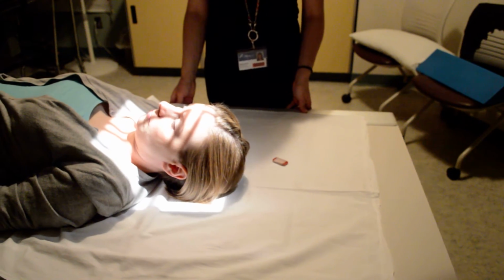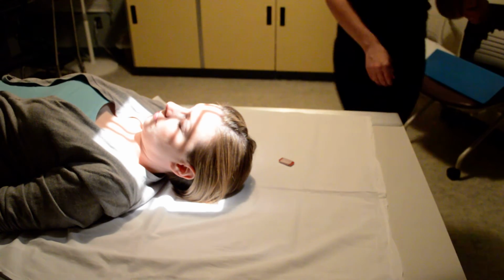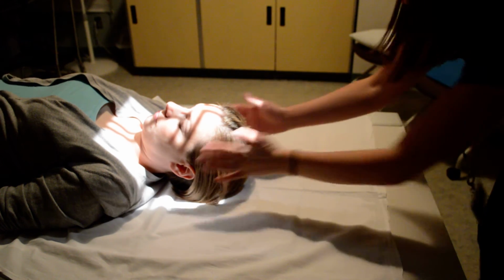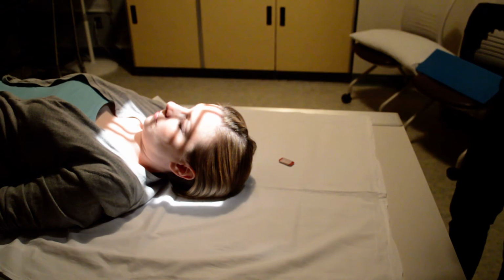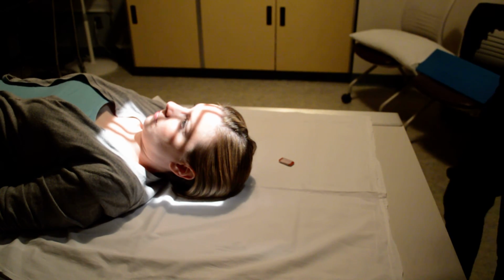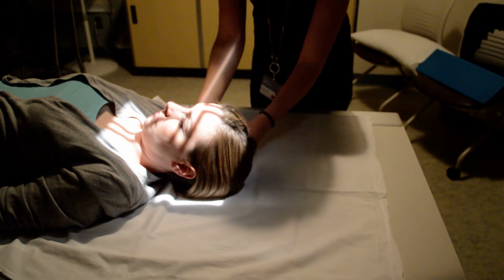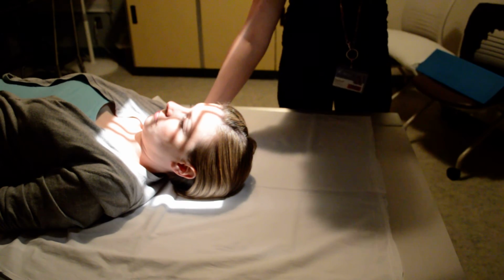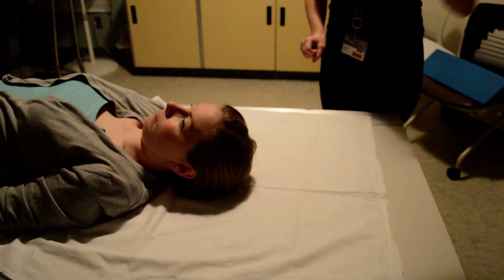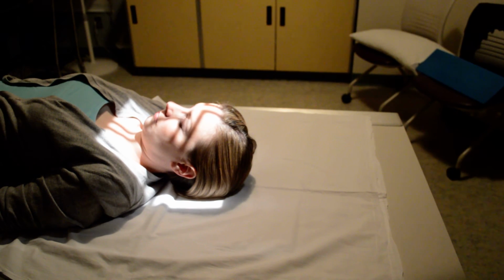And then for this one, we're going to be entering at the glabella. Collimation for this, I would leave it open the full length of 12, and collimate side to side a little bit for 10. You'll have some space on either side. I'm going to open it up just a hair more so that I have room for my marker. Measure directly through your central ray. Ask your patient to hold still and click.